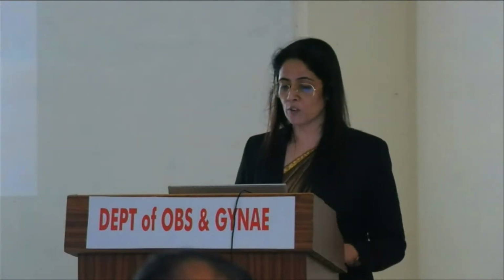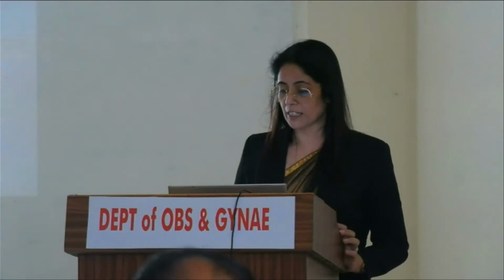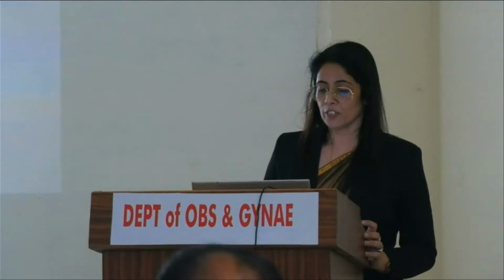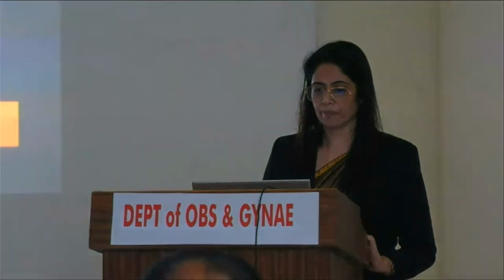So the main indications of an 11 to 14 week scan are, first, we screen for aneuploidies, then we assess the anatomy of the fetus for early diagnosis of major structural fetal defects. Then of course we have to date the pregnancy around this time, and diagnose multifetal pregnancies, confirming chorionicity and amnionicity. And we also do a uterine artery Doppler now for the early screening of preeclampsia by looking at the pulsatility index of the uterine arteries.